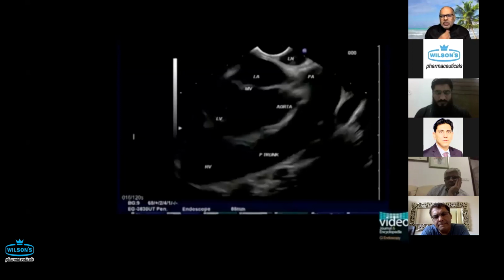In the initial stages, when this was not there, we published a review of 80, 90 cases, and we used to get more. But I remember one of my trainees was doing it when he didn't realize that there were esophageal varices. Even that was not a problem, because we went in and just banded them. He had just accidentally put a needle in that. So I think by and large, it's quite safe.